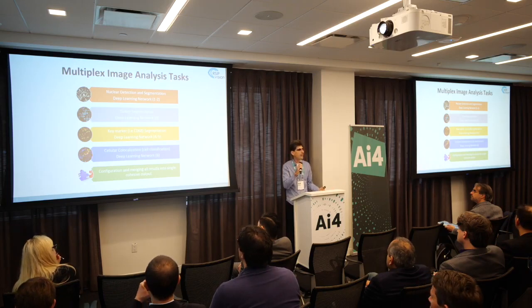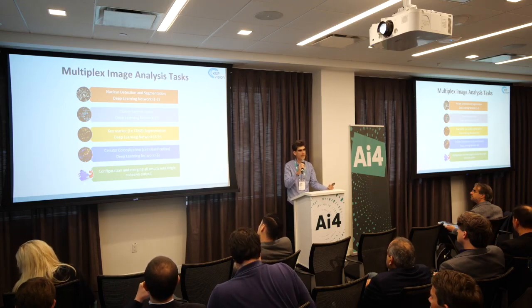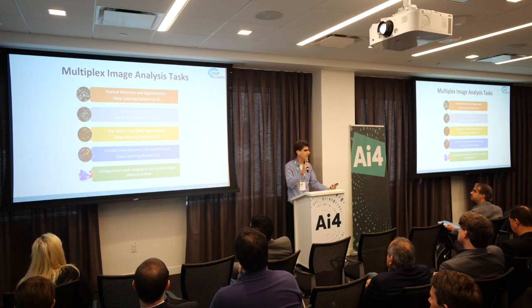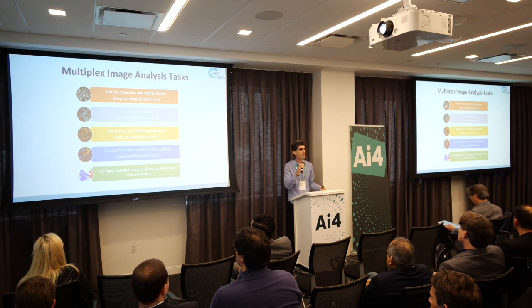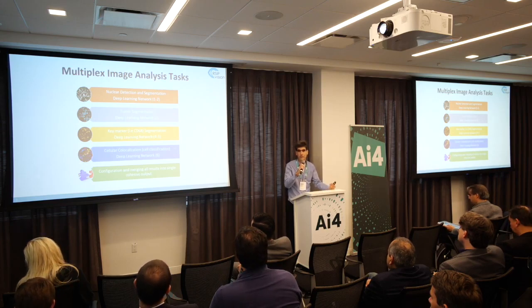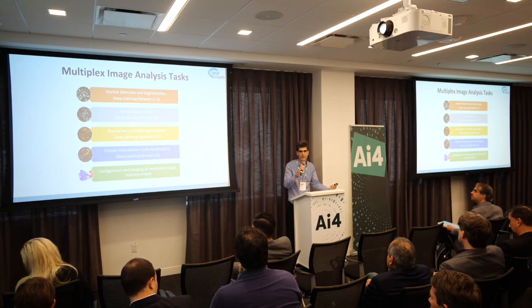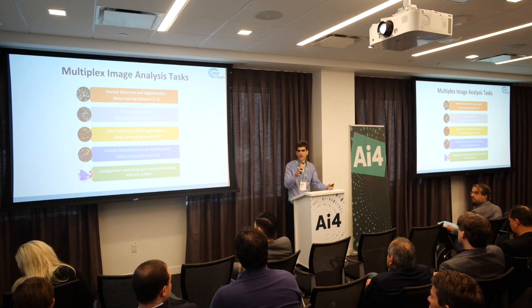We want to do it the way pathologists do it, not only to have all kinds of predetermined thresholds on the responses in different channels, but rather build a more general purpose, more scalable system that can tackle more difficult tasks. And then afterwards, you want to configure this to merge all the different results into a single cohesive output to be able to tabulate the results and use them for research and so forth.